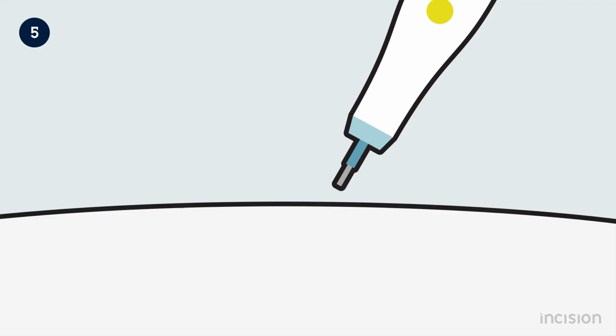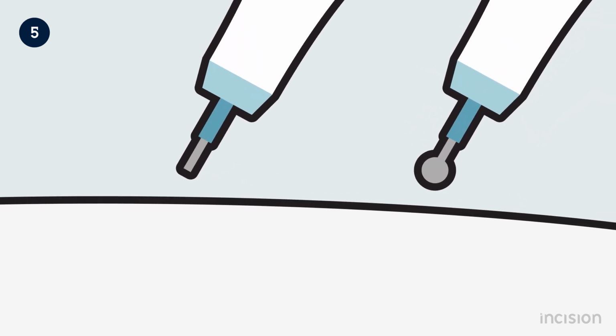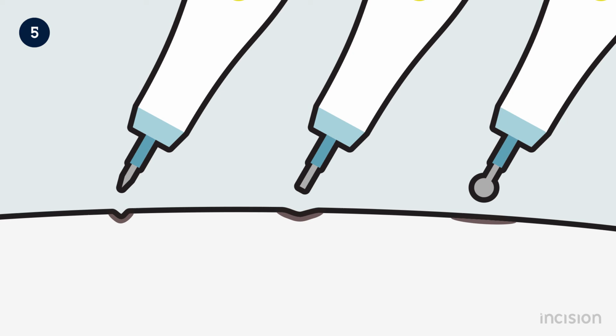Logically, increasing the contact area of the electrode tip reduces the current density in this tissue at the point of contact, making it more suitable for coagulation purposes. Decreasing the contact area increases the current density, making it more suitable for cutting purposes.